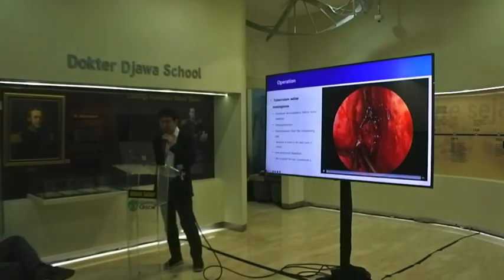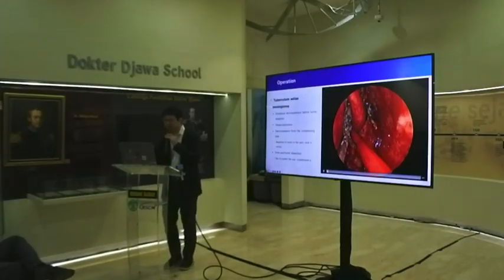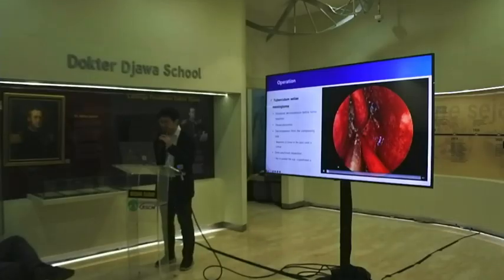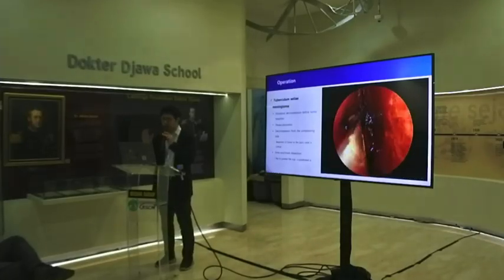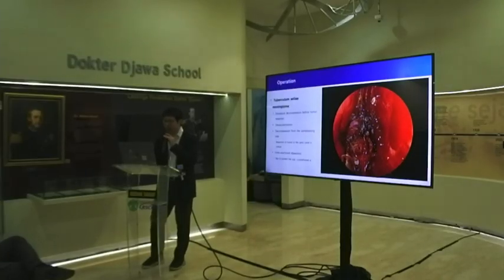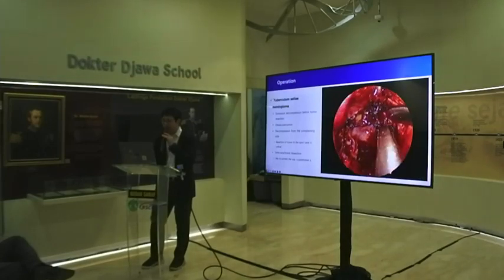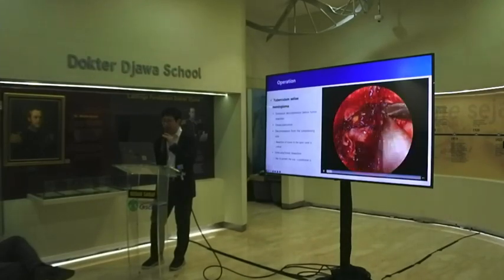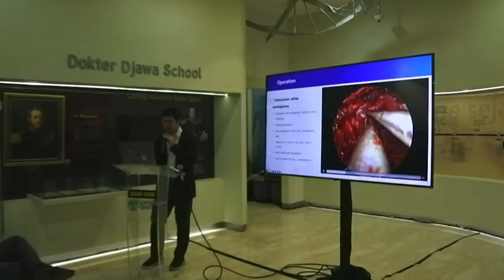And this is the surgical clip for the tuberculum sella meningioma. For tuberculum sella meningioma, the goal is devascularization and resection of the tumor with careful decompression of the optic canal. And it is important to protect the superior hypophyseal artery after drilling out all these bony structures.